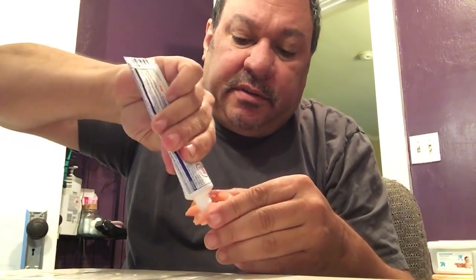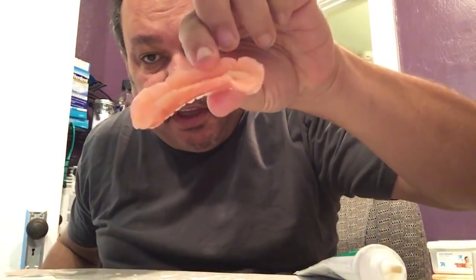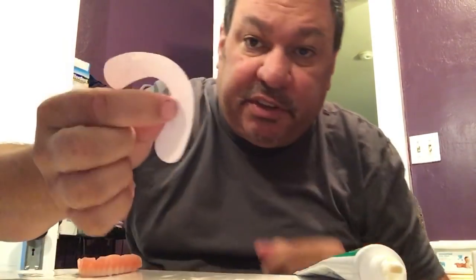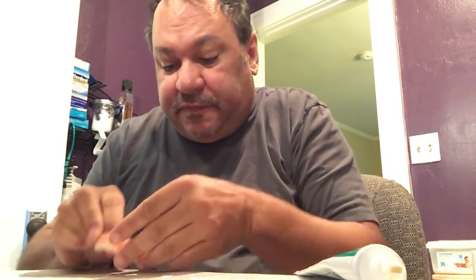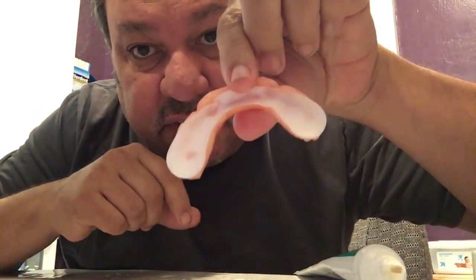I do the same with the bottom. I put a little here — I use a lot less on the bottom because I don't have that much area. This thing just barely hangs on, it's amazing it works at all. I don't trim this at all, I just kind of fold it and mash it in there.